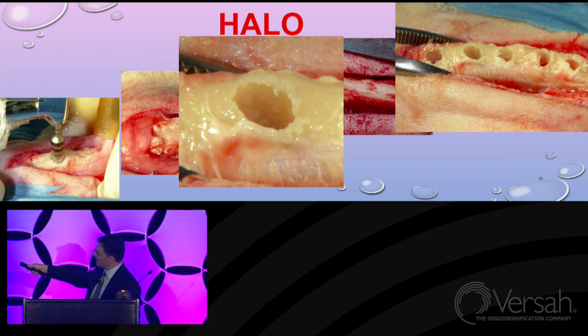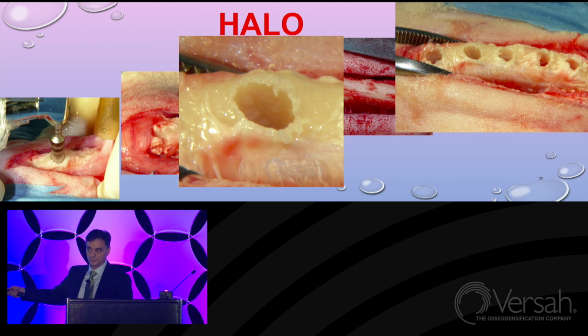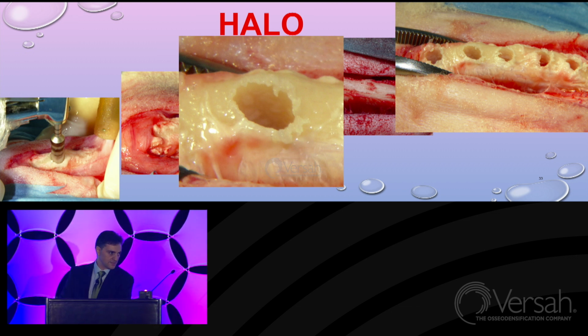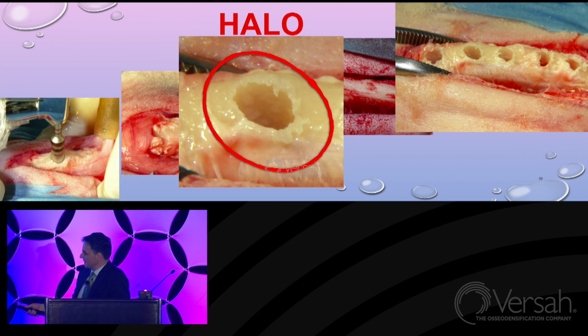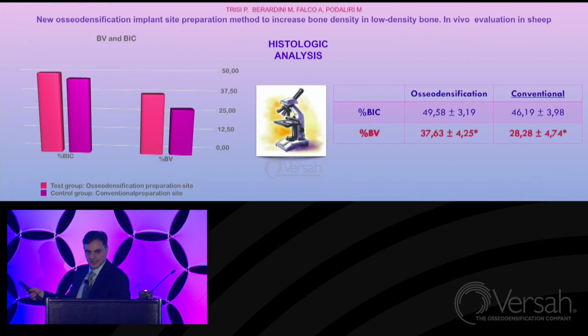And you see the diameter of the crest as compared to the diameter of the hole. It was really difficult to drill a 5 millimeter hole in such a crest. And these are the data. This is densification. This is conventional standard drilling. The BIC, bone to implant contact after healing, is almost the same, 49 versus 46, not so much difference.